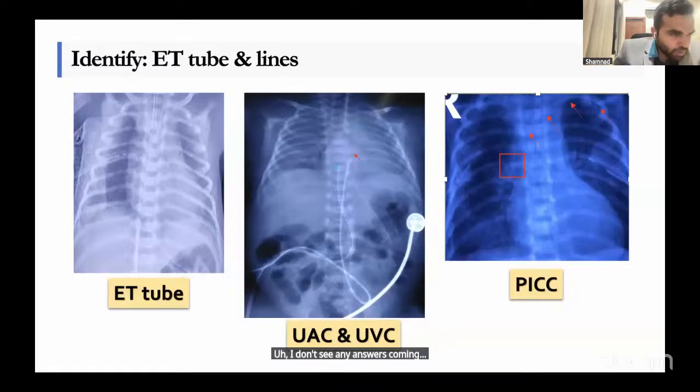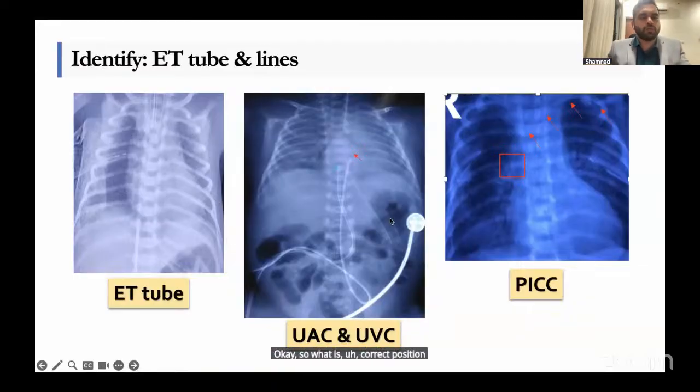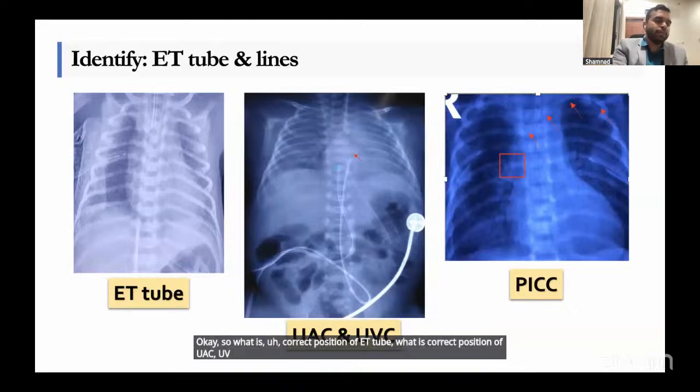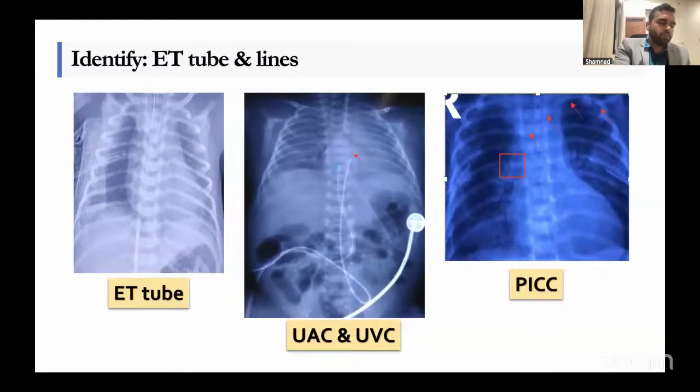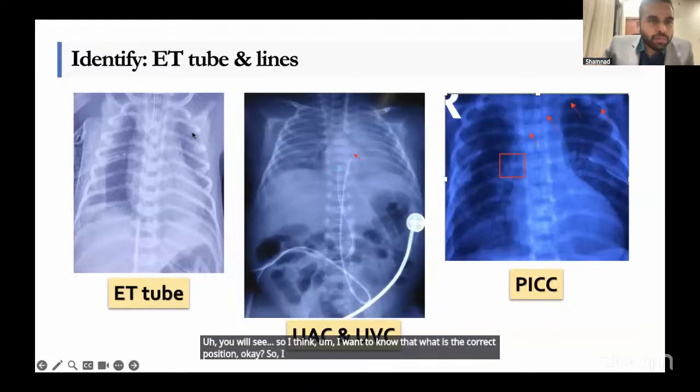Dr. Vijay Kumar, what is it? Okay, so what is the correct position of the ET tube? What is the correct position of the UAC, UVC, and PICC line? I want to know the correct position. Okay, so I think we'll proceed.